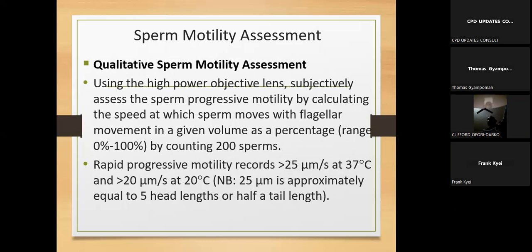Somebody comes to look at this and says, look at the neck. The neck is not too smooth, and therefore it's abnormal. You understand? So when it comes to some of these things, because of the element of subjectivity, results can sometimes vary, and there's nothing you can do about it. That is the challenge with the testing as it is.